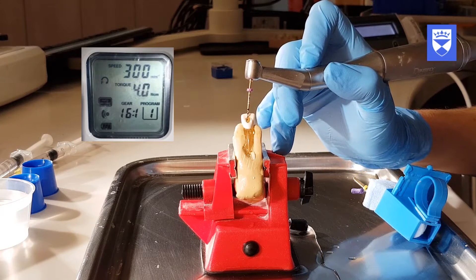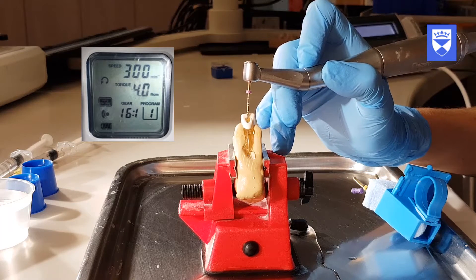Ensure that the endodontic motor is set to the correct parameters for the ProTaper Gold files.